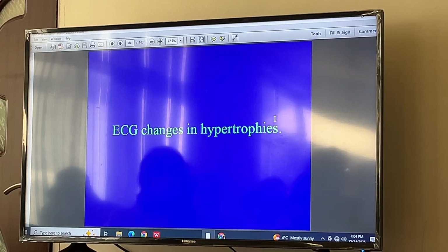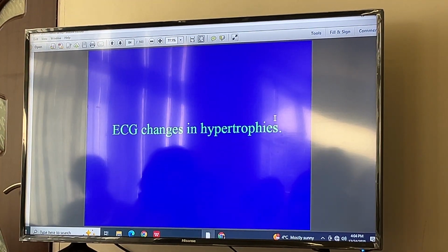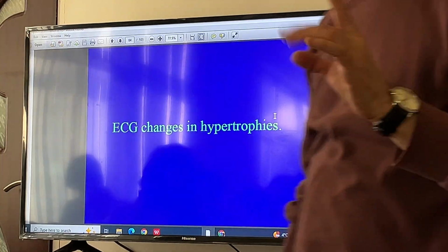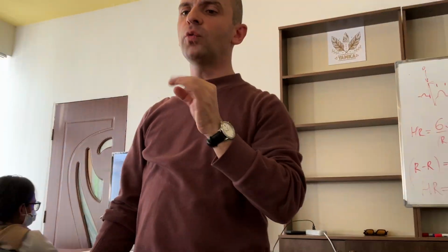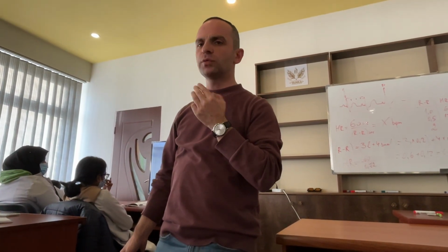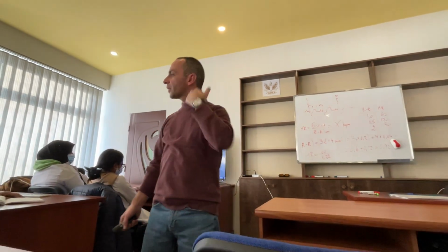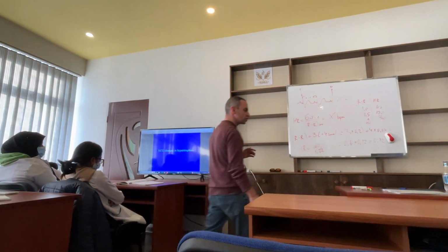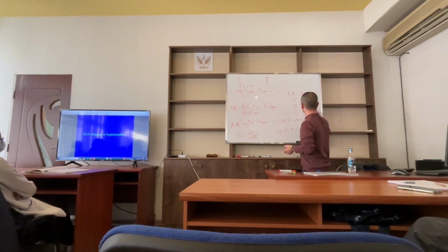Okay? So what is left for us is our hypertrophies. I will explain this now, and pacemaker determination. But please complete this at home to be clear. And one last thing: how did we get this 300? For many years, I was telling students that it's some empiric value. We are dividing 300, but 300 is not coming out of nowhere. It has a meaning. Now look.